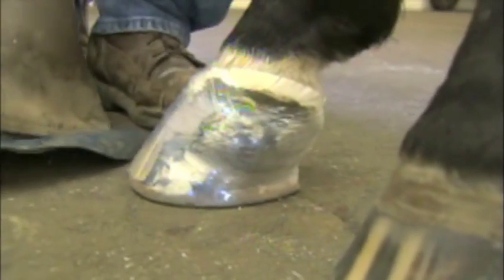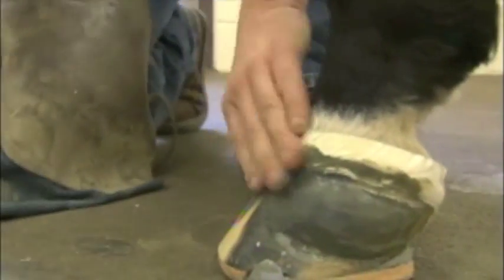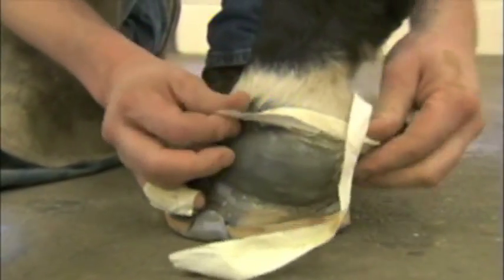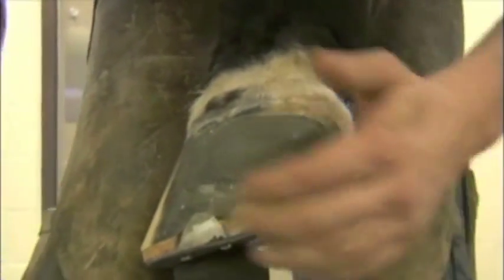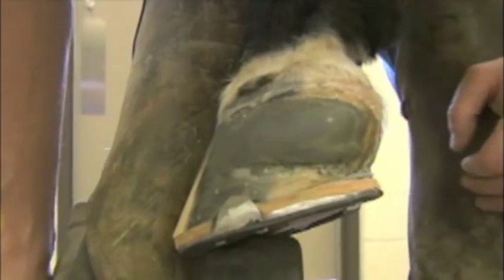Just let that cure — it should be ready. Pull that wrapping off again. This looks a little better, a little tighter. Pull this tape off. I like to make sure there's no glue on the coronary band, that's why I put tape on there, and if I get any up under I'll clean it off. Looks pretty good — that's a good strong patch that'll last a couple of shoeings and really stop the movement of that crack so it shouldn't bleed.